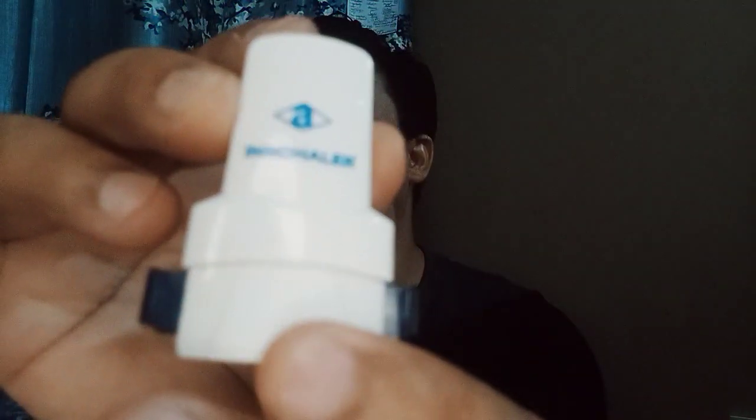Now this is a specific inhaler. This is an inhaler from Alchem. Basically, this also opens like this. I will basically restrict myself to Lupihaler only. I will demonstrate how to use a dry powder inhaler with Lupihaler.